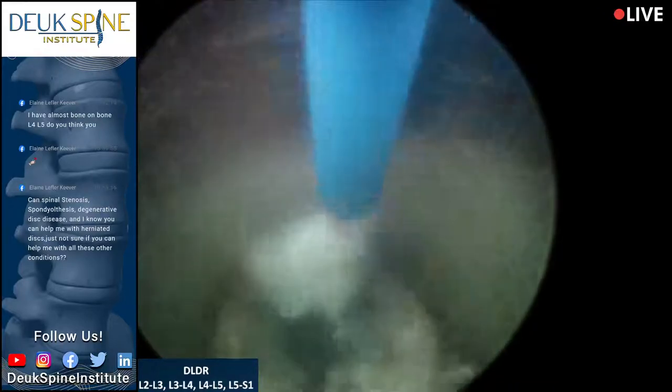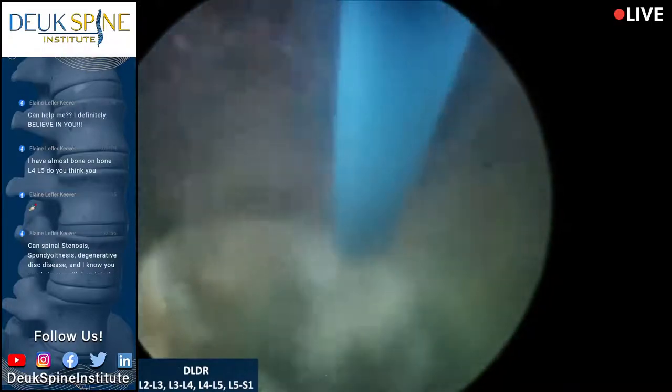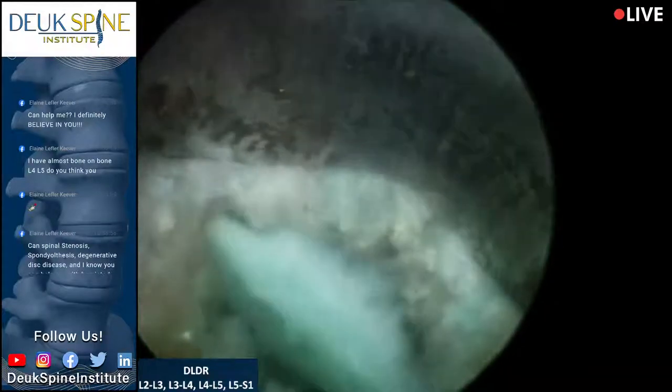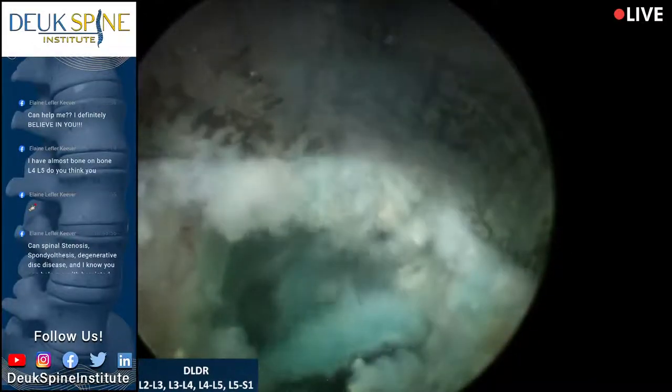The pain is due to a tear in the back of the disc. And that's what I'm fixing right now with an endoscope. So you don't need to have a major surgery. No matter what your doctor tells you, you don't need it.